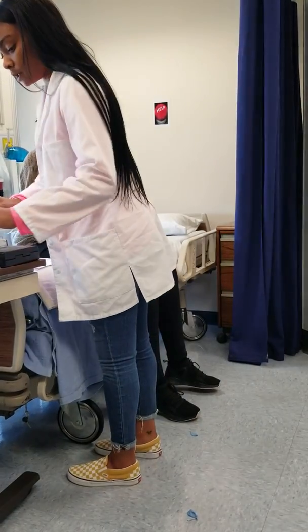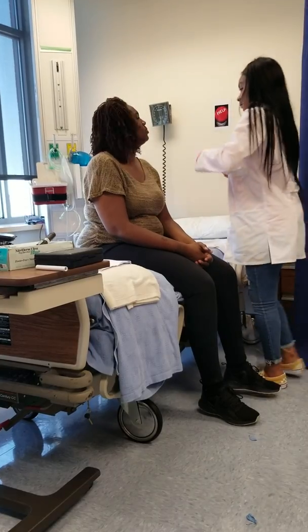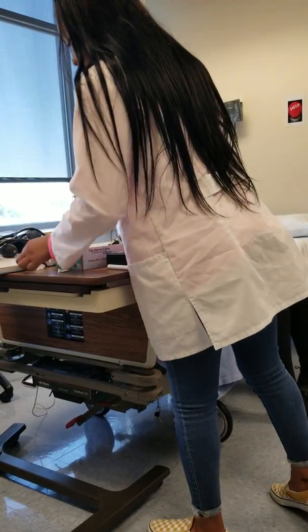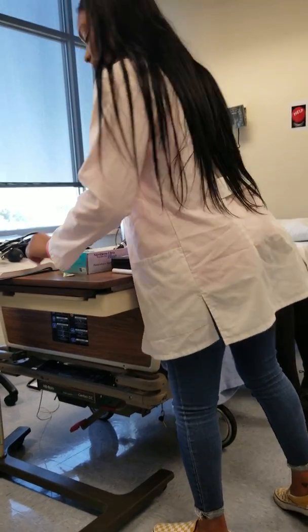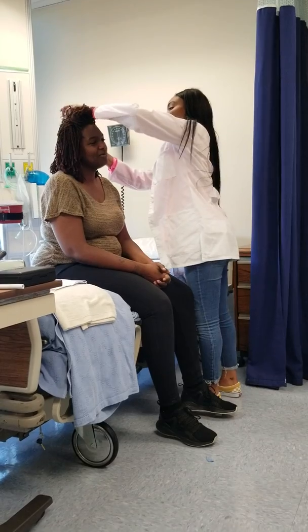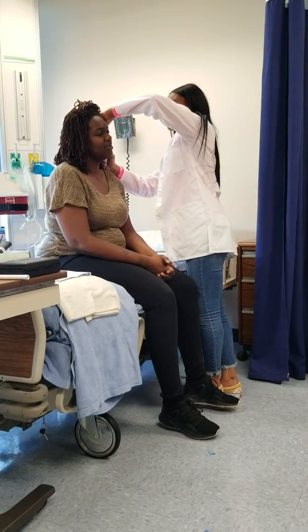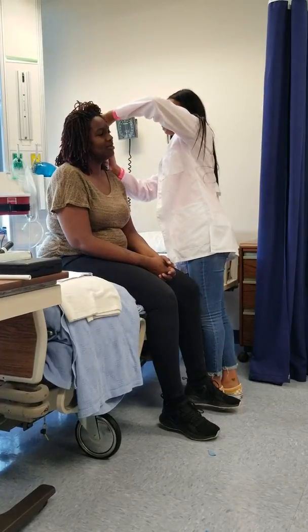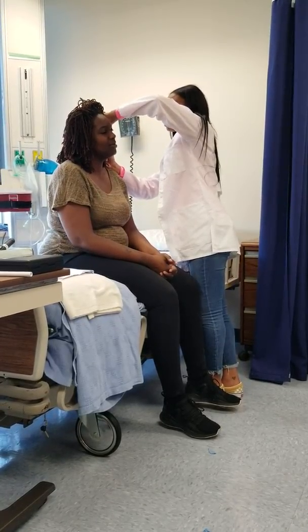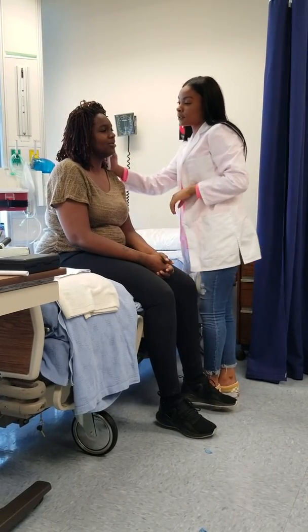So I'm going to take her tympanic temperature. I'm going to clean this off because good nurses are clean nurses. And as I do this, I'm assessing for movement of the auricle and her tragus. I'm pulling her ear up and back because she's an adult. 98.6 degrees.